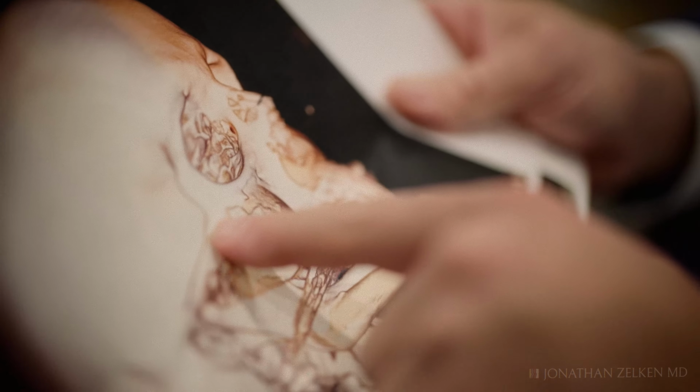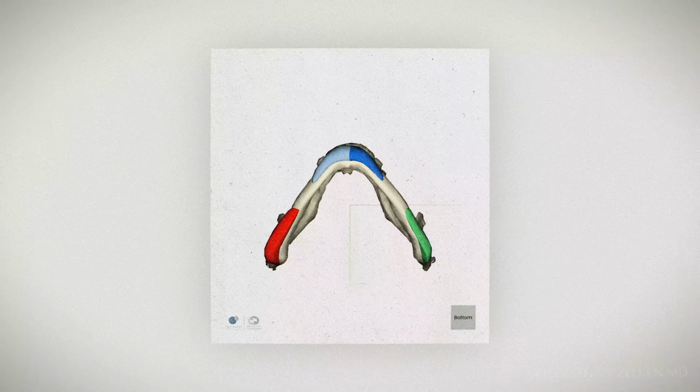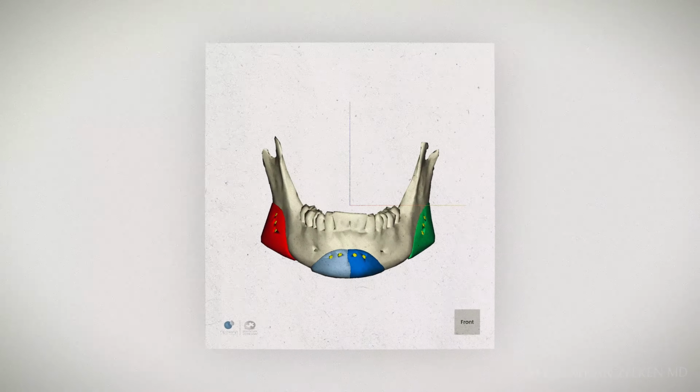For applications like the chin or perinasal region, I find that silicone implants work very well. But when it comes to sort of asymmetries of the face and also the jaw angles, also even the cheeks, sometimes these one-size-fits-all options fail. The best solutions that I've found have been custom implants. They make custom implants out of silicone, of course, but what I've really fallen in love with are the thermoplastics, the advanced polymers.